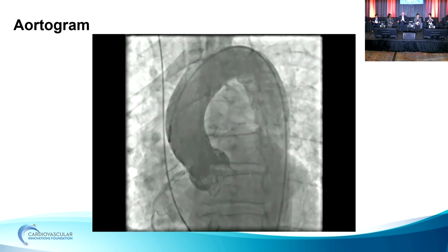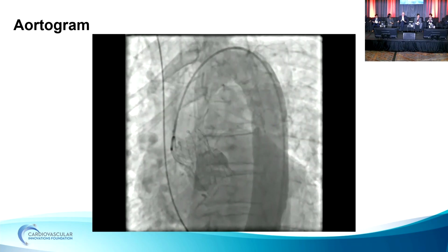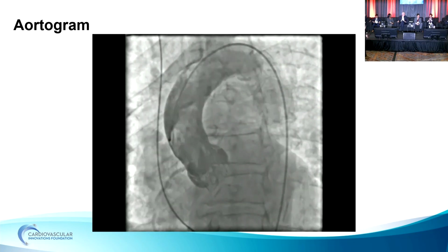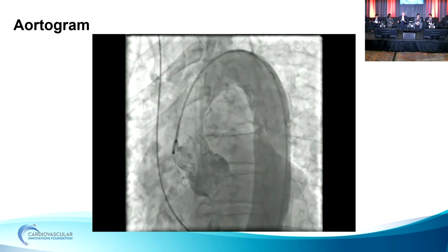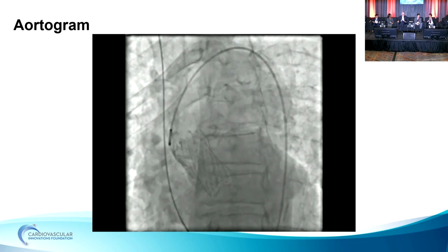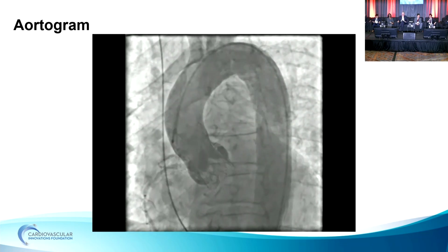Actually, on your aortogram when you were positioning, there was probably not any flow into the left main. You probably scrutinized that. Could that have been a clue for a recapture? We'll go back to that. But these are a nightmare. I know you must have an algorithm of trying to get in there. One of the bailouts is to put 2 snares and pull the valve away. But I'm going to let you talk some more.